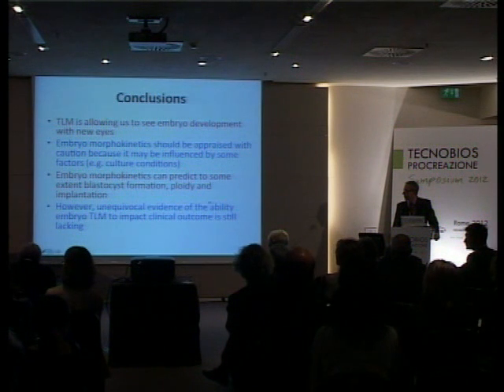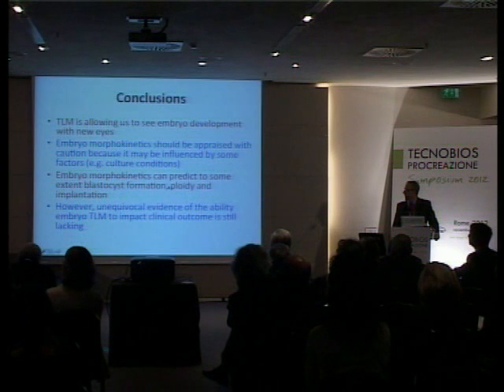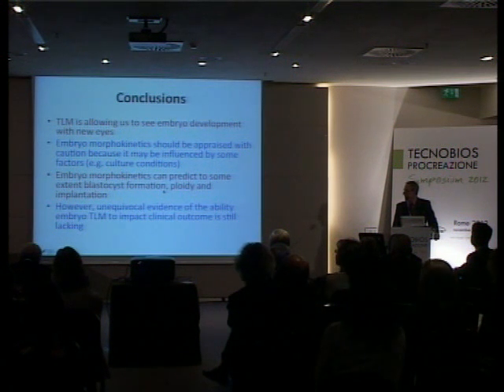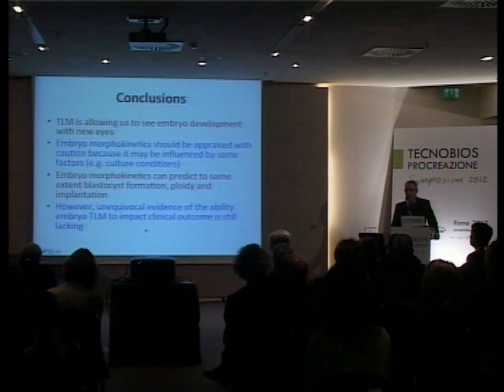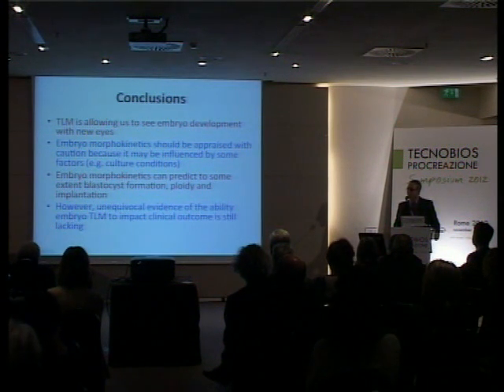And so what we can see is that there are suggestions that we can predict embryo blastocyst formation, blastocyst quality, ploidy, but these are only limited data that have to be confirmed. The same kind of conclusion may be applied to the clinical outcome. There is a suggestion that it may work, but we don't have a definite answer yet.